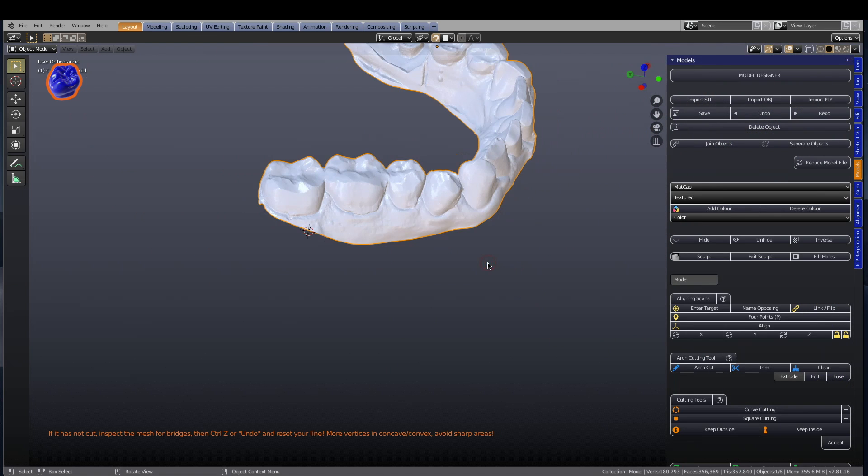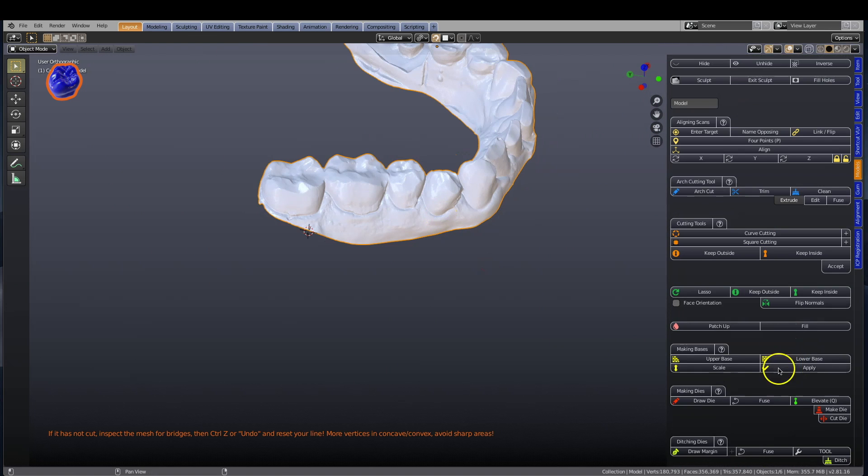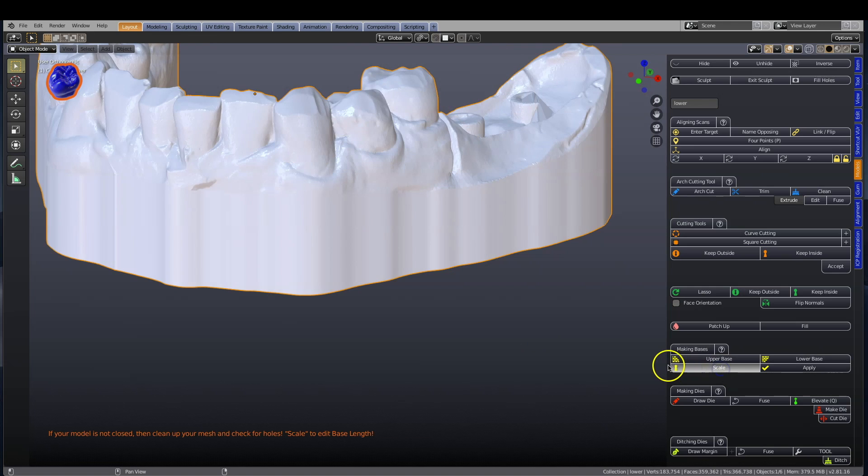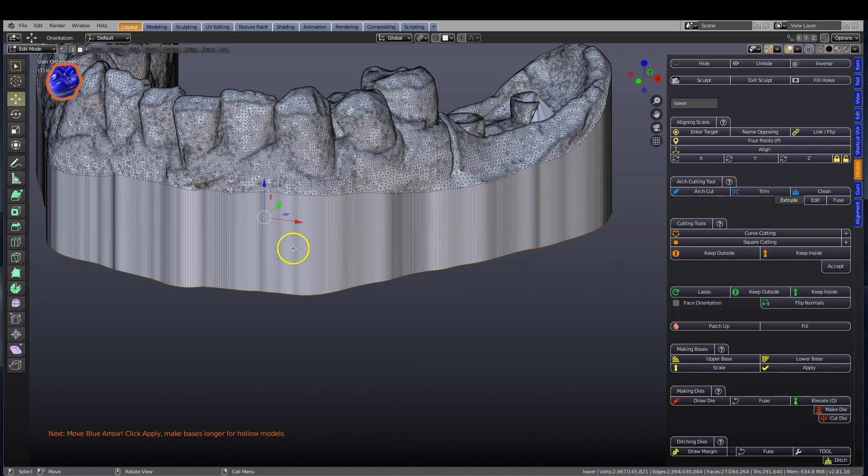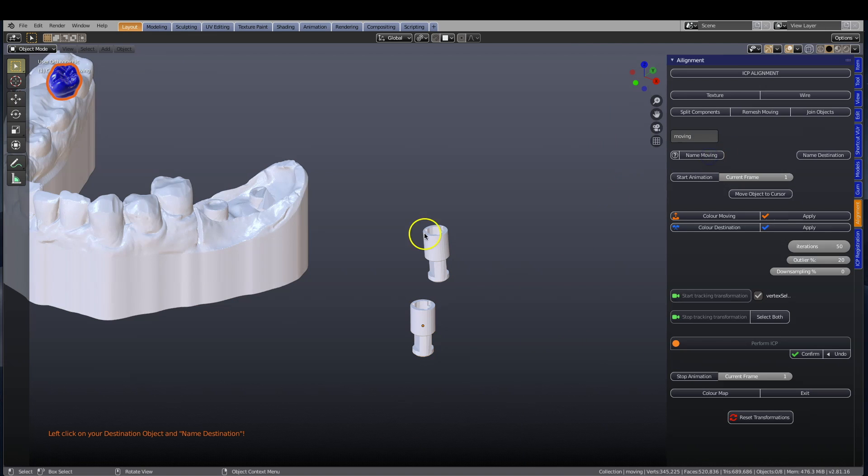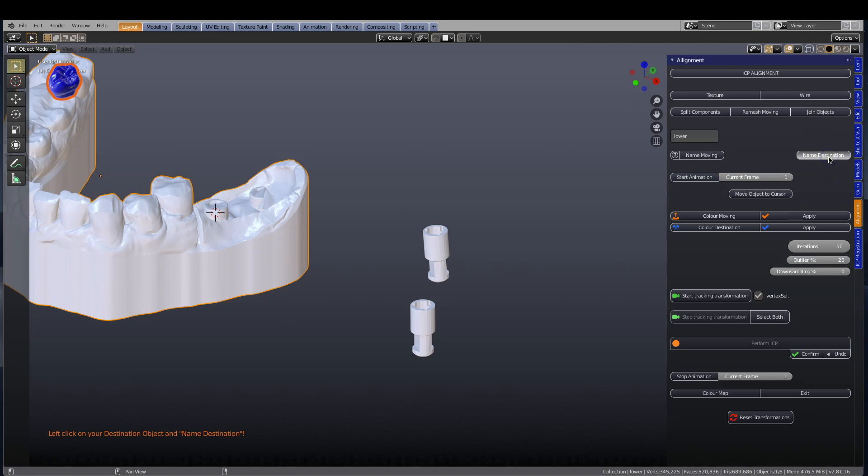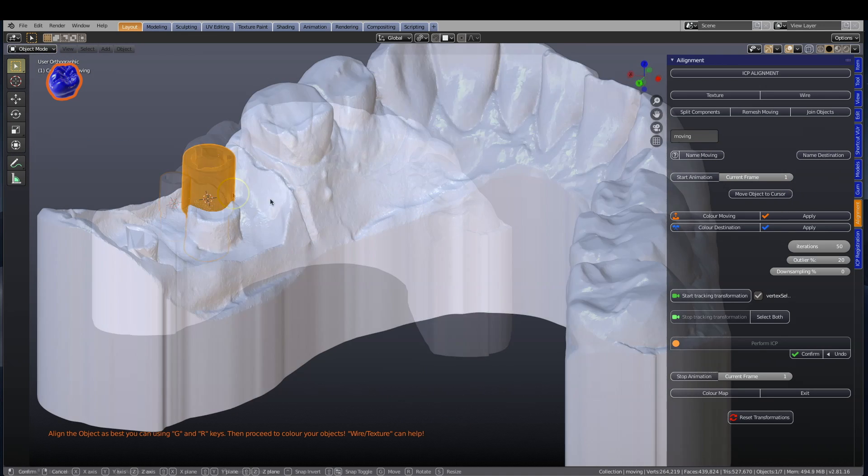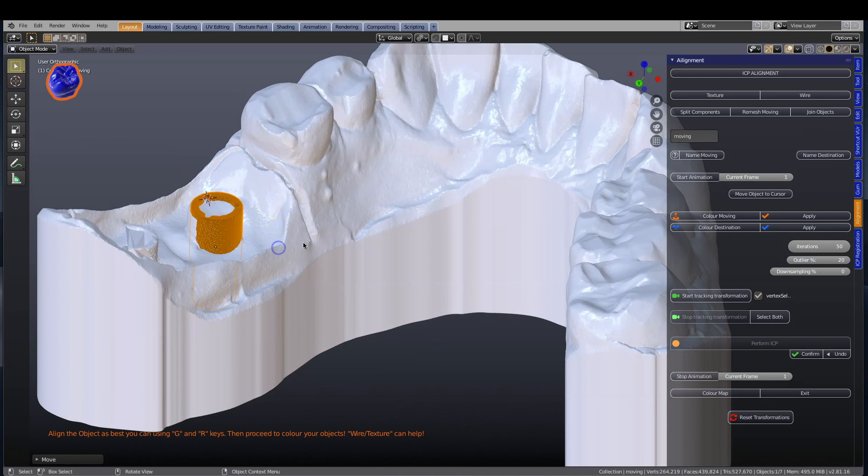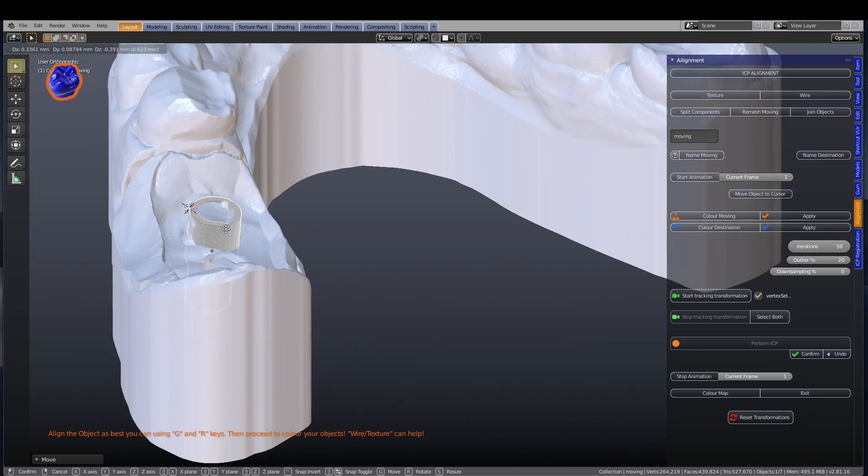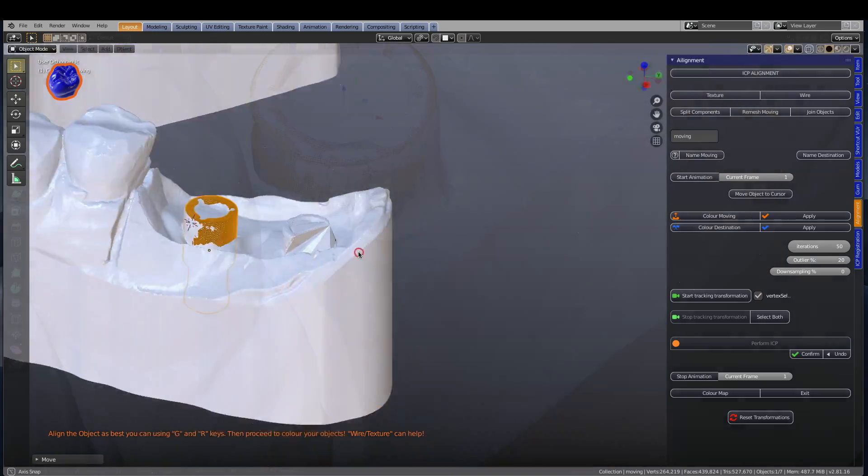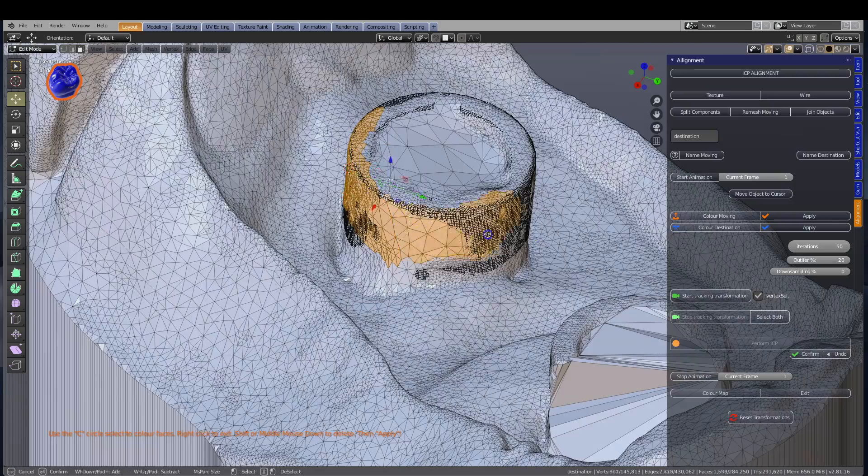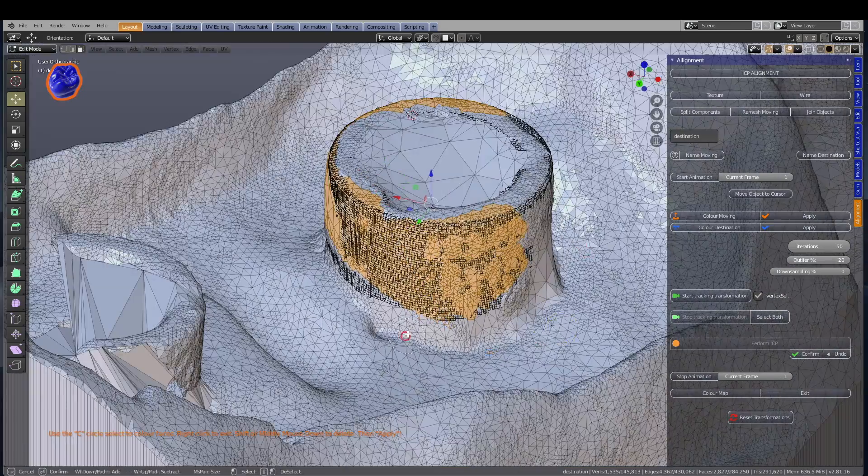Turn your intraoral scans into amazing dental models with the model designer, then explore some of the features of Blender for Dental's ICP alignment tool. Immerse yourself in Blender's stunning visual effects while learning from the easy-to-follow tutorials.